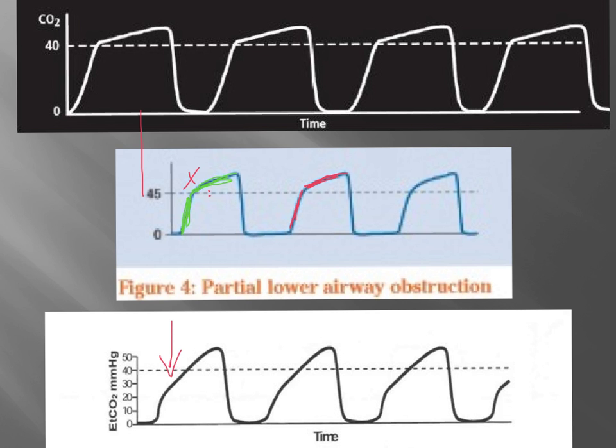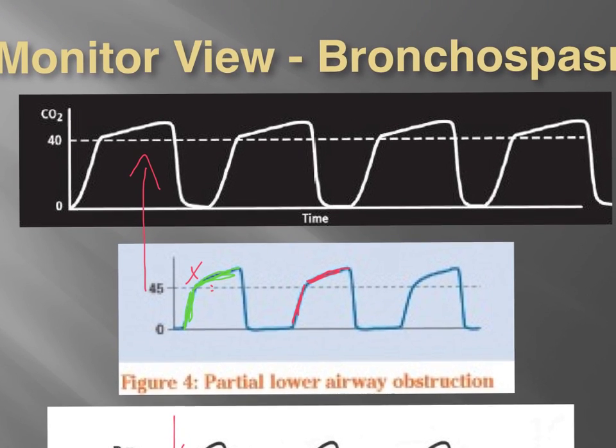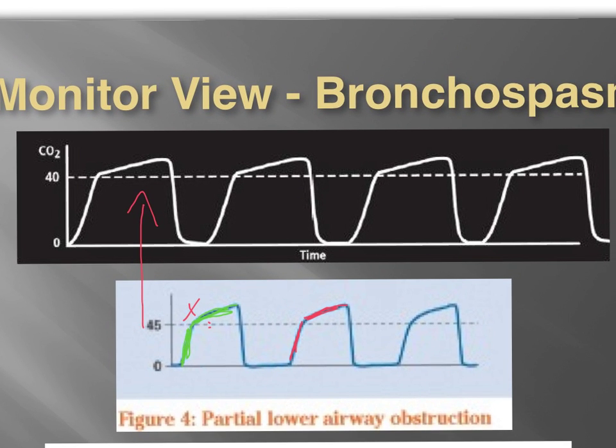If we're moving to a waveform up here, then maybe we're getting a little bit better, because we can see with this waveform, it's almost squaring up, but this is quite a bit of a rise yet for our waveform, and we can also see it's on the higher level of what would be normal.